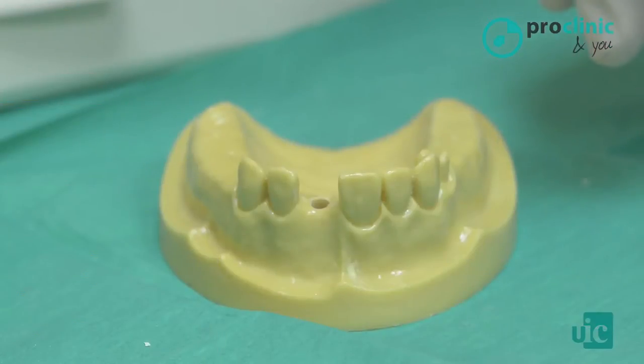Once the drilling sequence is completed, remember that we have to make an implant bed with less diameter than the implant in order to achieve a good primary stability.